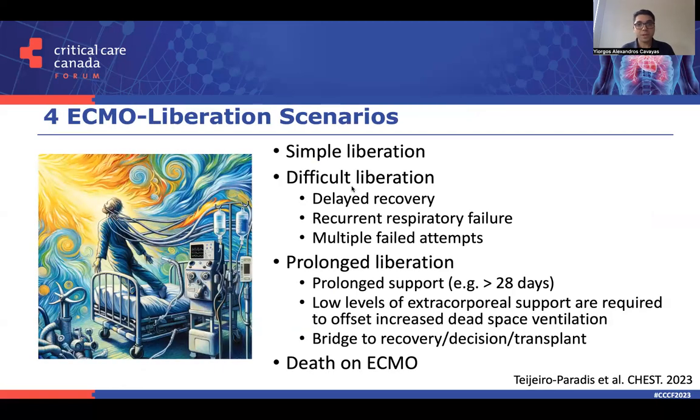Moreover, we can look at ECMO liberation scenarios in broad terms. And each strategy may offer unique advantages for each type of scenario. In some patients, we could anticipate a simple liberation. In such patients, daily liberation trials performed systematically may offer multiple advantages.